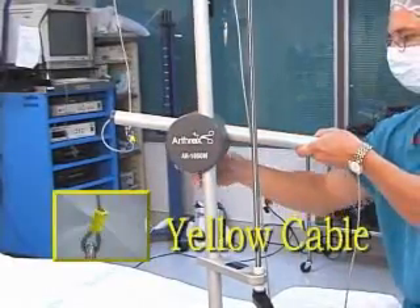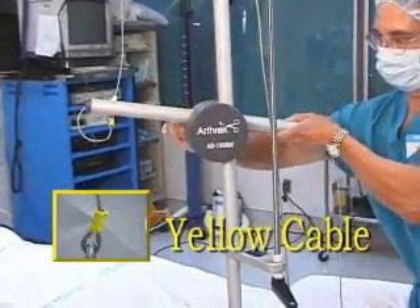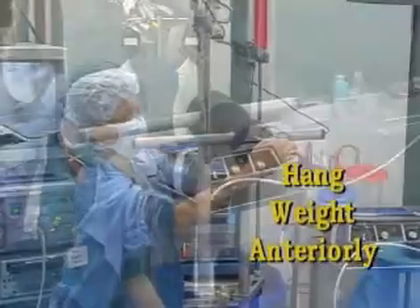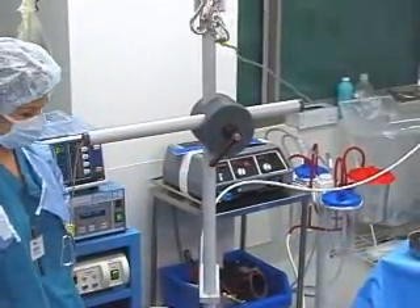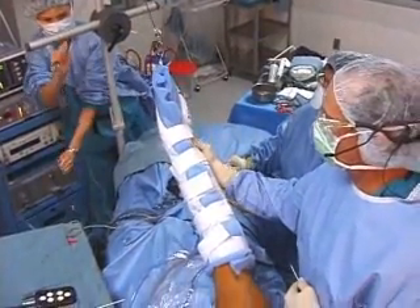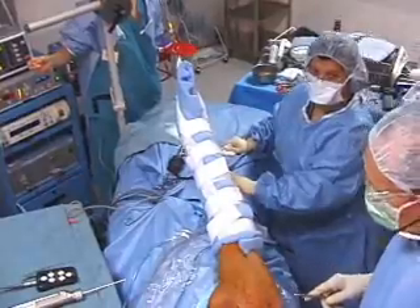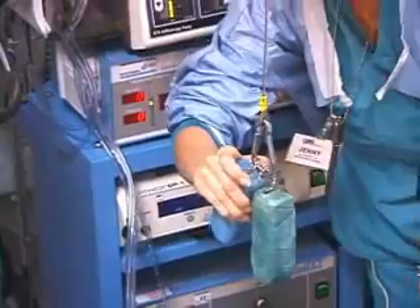The lower traction, which is the yellow cable, is adjusted for the appropriate sided shoulder being worked on. For 10 to 15 degrees of forward flexion, both the lower boom adjustment as well as rotating the traveling pulley are performed to accomplish a slight forward flexion. The lower traction is set so that the weights hang anterior to the patient. Changing the distraction in the middle of the procedure — from 70 degrees of abduction to 15 degrees of abduction, for example — is simply a matter of instructing the circulator to change the weights from the white cable to the yellow.